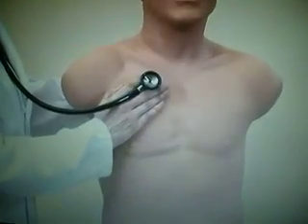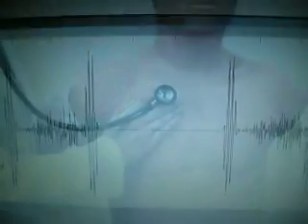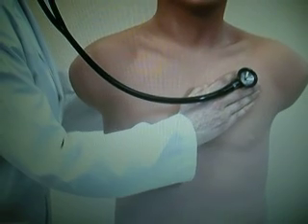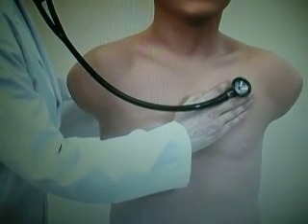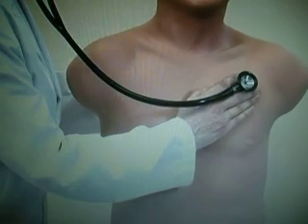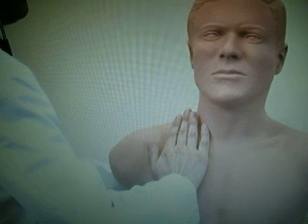Using SAMView Sounds display system, you can see the phonocardiogram of severe aortic stenosis. Simultaneously, you are hearing this sound as heard at the aortic area. Note that the murmur is throughout systole, with late peaking ending at S2. When the stethoscope is moved to the pulmonic area, the systolic murmur is still heard, but not as loud. Severe aortic stenosis can be felt in the neck as well.